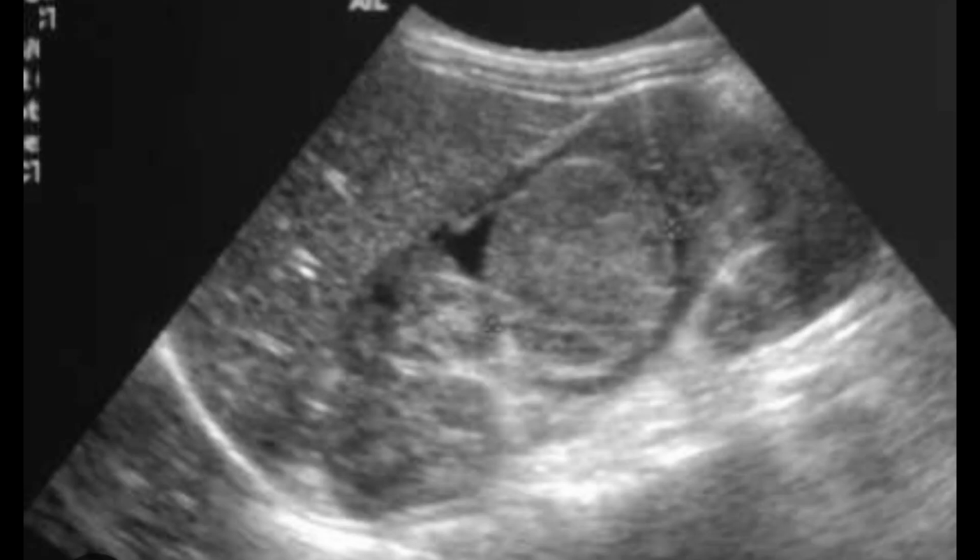So this happens to be Wilms tumor or nephroblastoma, and you need to have a biopsy. If you apply the Bosniak classification, it still falls in the malignant category, and it will be called Bosniak grade 4. So this is in the mid pole, without any compression, without any heterogeneous appearance, without any cystic degenerative changes, and without any calcification.